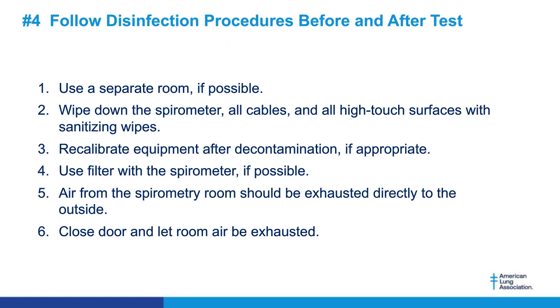Of course, we need significant disinfection before and after the test. If you have the ability to use a separate room in your primary care department, we wipe down the spirometer and all the cables and all high-touch surfaces with sanitizing wipes. This is why it's so important that we have a very sparse room, because anything that's within 6 feet of the patient doing an aerosol-generating procedure needs to be wiped before the next patient can come in the room.